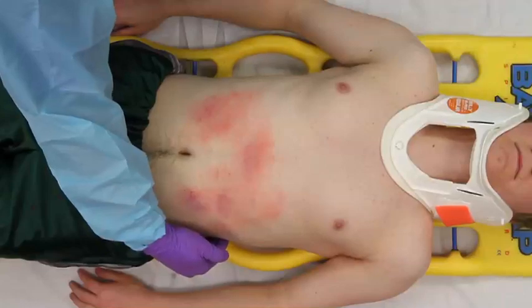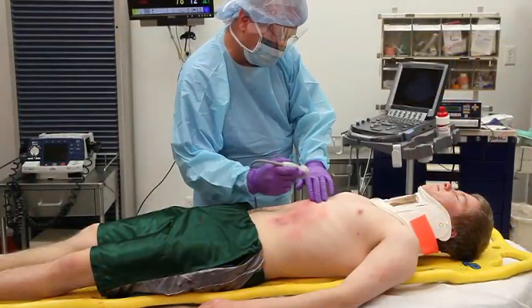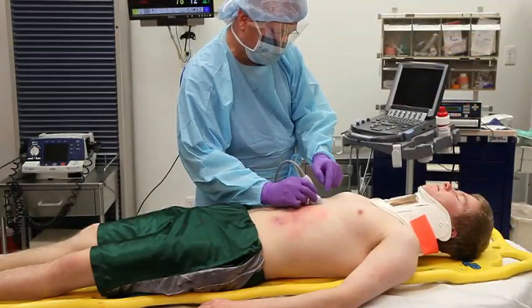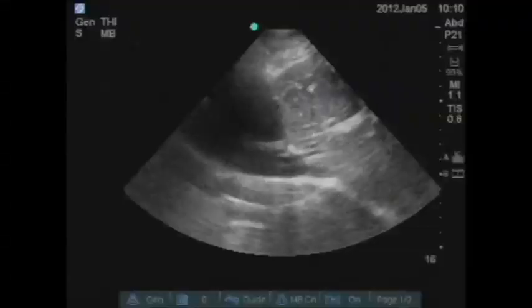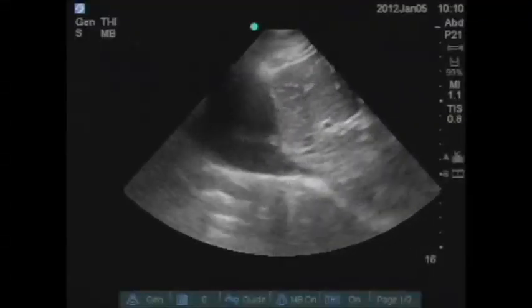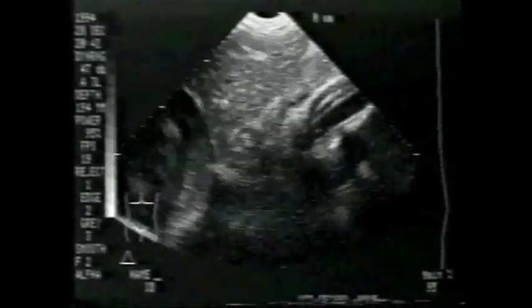Start by viewing the heart using the sub-xiphoid or the parasternal view to ensure the gain is set appropriately. Fluid within the heart should appear black. The presence of fluid outside the heart within the pericardial sac is abnormal and is consistent with pericardial tamponade.